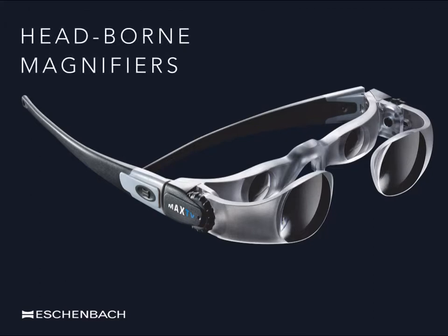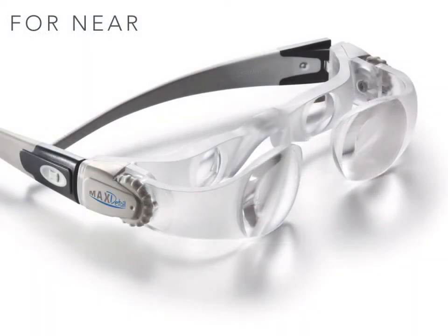Many head-borne magnifiers like this one are based upon a simple telescopic design. This type of spectacle-based magnification is available for both near and distance viewing. Giving two times magnification for near viewing, this magnifier is made up of two sets of lenses — front and back. The distance between the two sets of lenses is adjustable for each eye, allowing the user to set the precise level of focus.